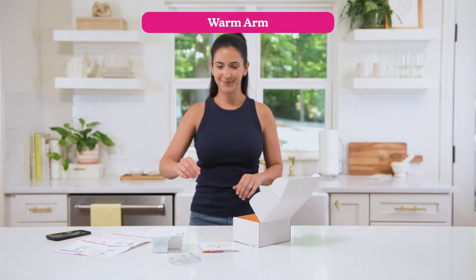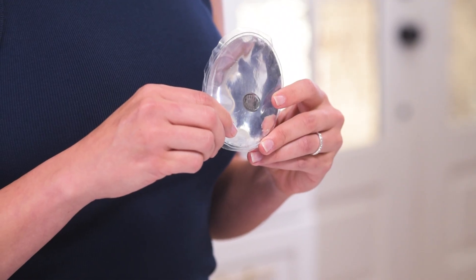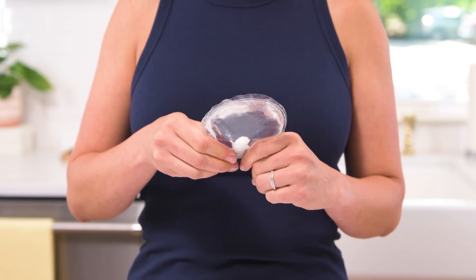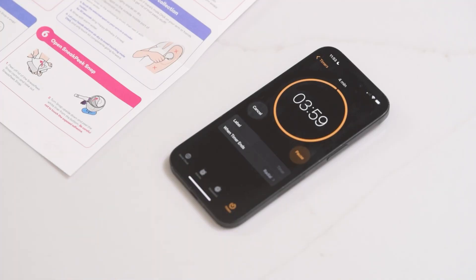Now it's time to warm up the area to help the blood flow. Take the warming pack and hold it upright so the metal disc floats to the bottom. Bend the disc back and forth until it clicks and the pack turns cloudy and warm. Place it on your collection spot and set a timer for four minutes.